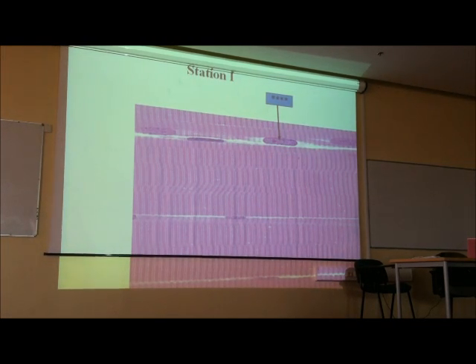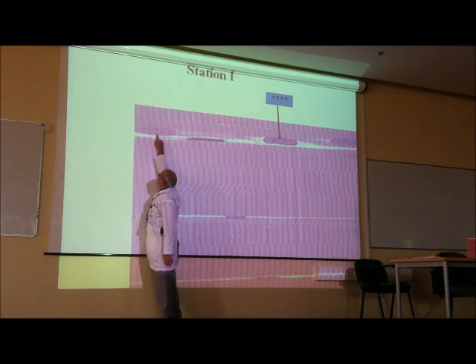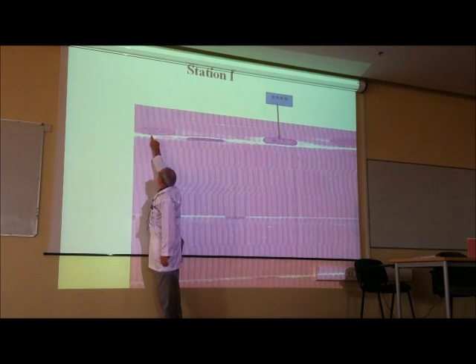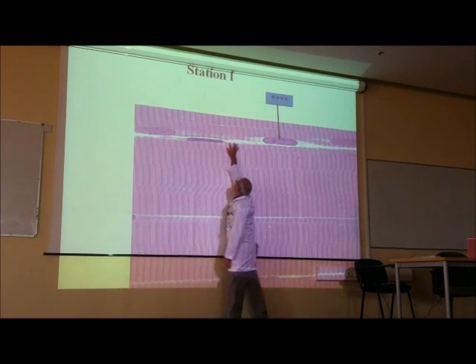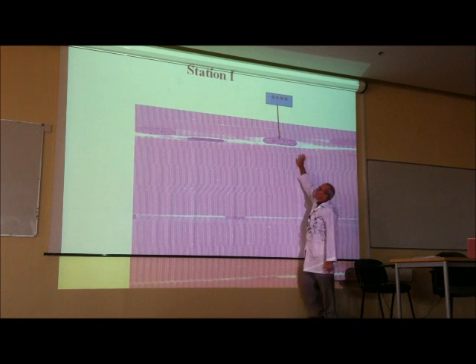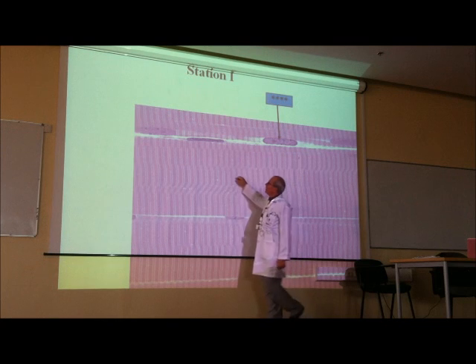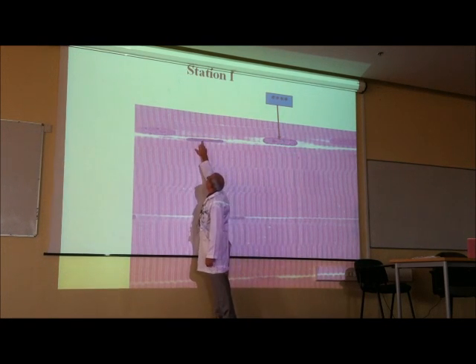Is it the nucleus? And the nucleus is peripheral? Yes, yes. Look here. Go with my finger. What is this? Nucleus. Go with my finger. So it's intracytoplasmic. But here, the nucleus is extracytoplasmic and dark.